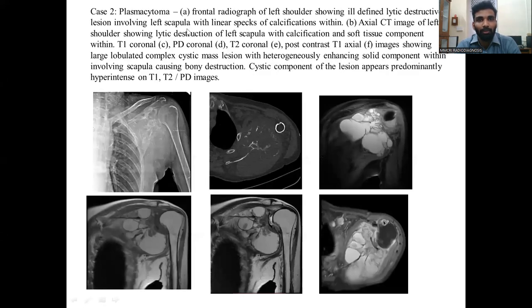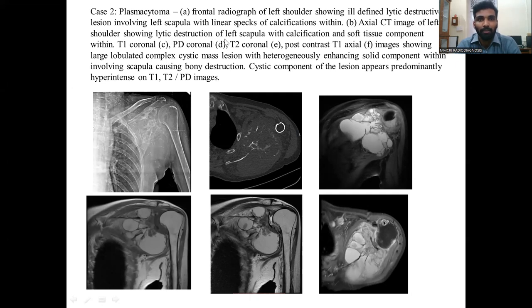Case of plasmacytoma. Frontal radiograph of the left shoulder shows an ill-defined lytic destructive lesion involving the left scapula with faint specks of calcification within. Axial CT of the left shoulder shows lytic destruction of the left scapula with calcification and soft tissue component. T1 coronal, proton density coronal, T2 coronal, and post-contrast T1 axial images show a large lobulated complex cystic mass lesion with heterogeneously enhancing solid component involving the scapula causing bony destruction. The cystic component appears predominantly hyperintense on T1, T2, and proton density-weighted images.